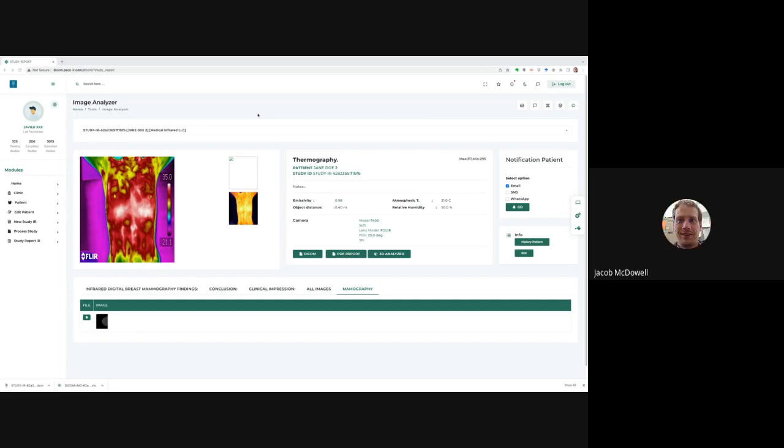Yeah, I guess because I don't understand. I've just seen the Narami report, and it has basically a color image that's regenerated from the raw data that was sent to them out of the camera. It shows the regions, and maybe it would also have a finding report from the interpreter that would go back to that. When you see the report, it says this hot area, or whatever. Along with that, there is actually a regenerated image of the breast.